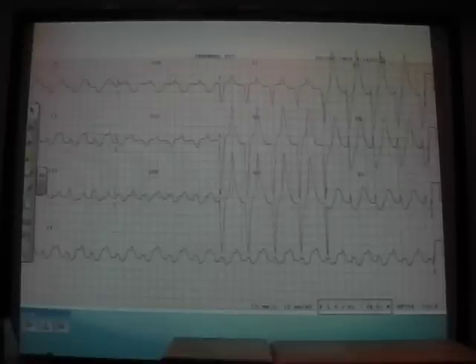So what's the rate? Quite difficult to tell, isn't it? It's 90. Brilliant. Rhythm. Is that P wave bifid? No, it's the T and the P next to each other on the rhythm strip. Yeah, this is a very abnormal ECG.